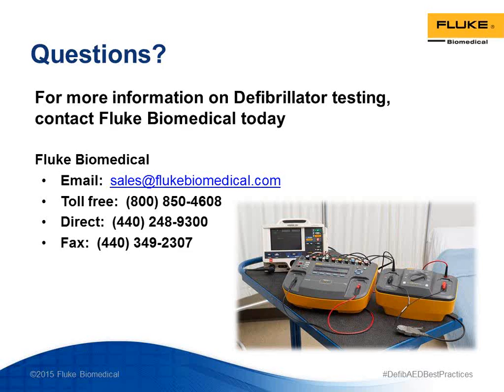Well, I'll refer you to a soon-to-be-available curriculum that we have, and one course in particular within that curriculum, the defibrillator testing course. That curriculum is about medical device quality assurance. We teach a method by which you use a risk-based assessment of any medical device, including defibrillators, and a series of criteria and answers to those criteria to determine the most appropriate frequency of inspection.